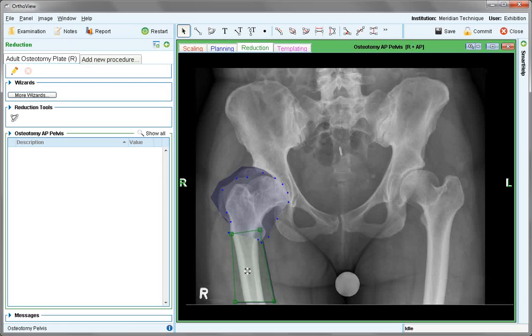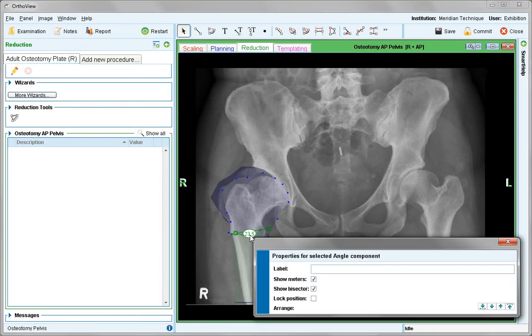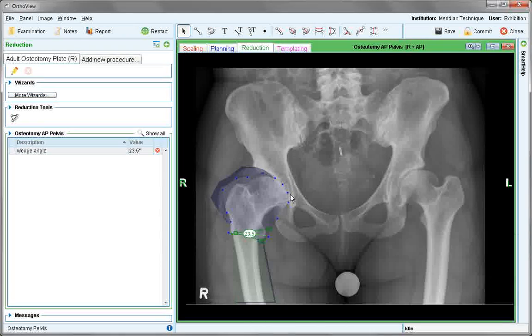In order to get the angle of the wedge necessary to achieve this plan, choose the angle tool and place that over the two segments, allowing the angulation to be read. Right-click if this is to be labelled.